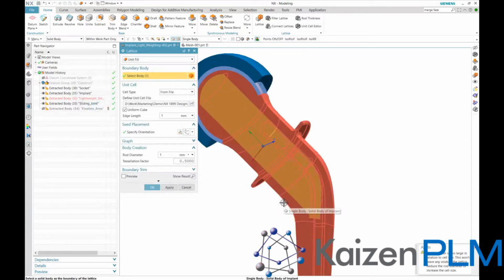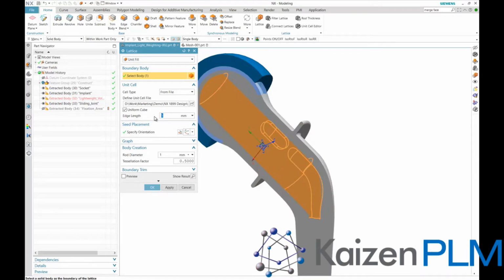With the volume to fill defined and the lattice cell type defined, we notice in the lower right corner that the system returns feedback and warns that the rod size is in violation to the cell size and that the result would most likely be undesired. We therefore modify the cell size to something more suitable, and we modify the rod size as well. The small cell preview in the middle of the volume in the graphical screen gives us an indicator to what the lattice pattern will be like.